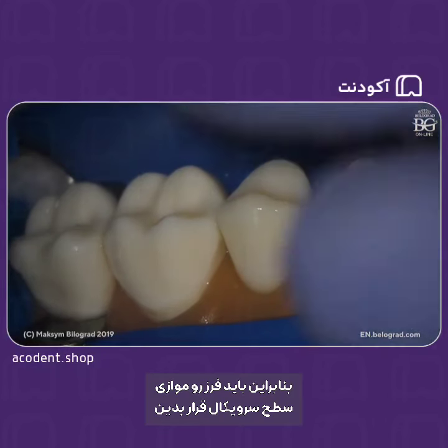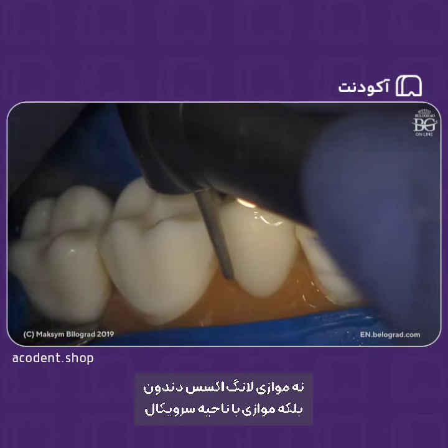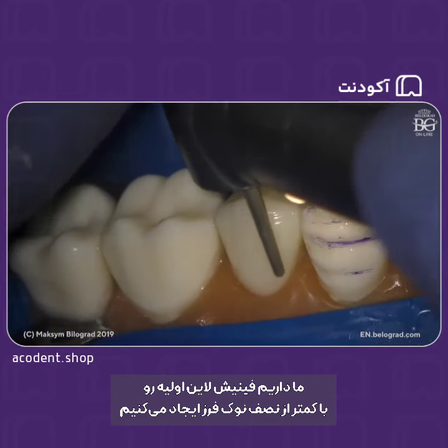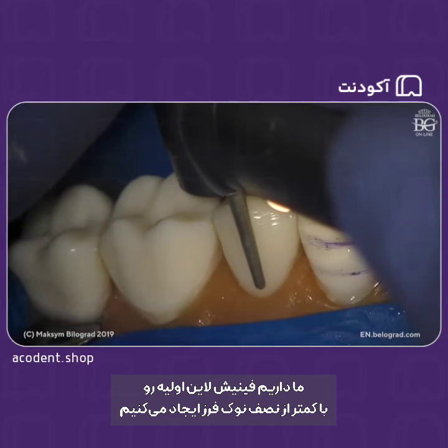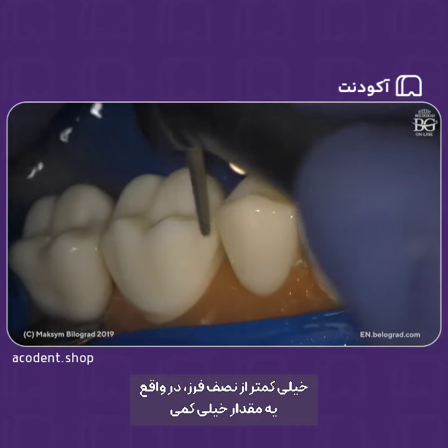So you have to keep your burr parallel to the cervical area now, not to the long axis of the tooth, but to the cervical area. We are doing the initial finish line using less than half of the tip, just making a scratch.